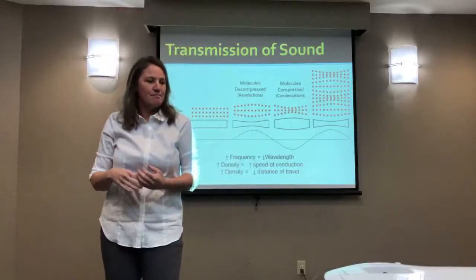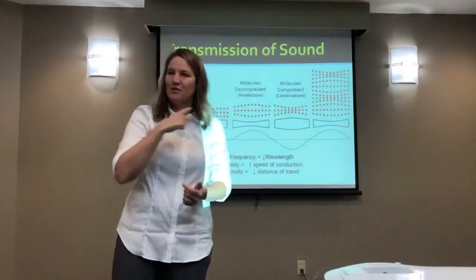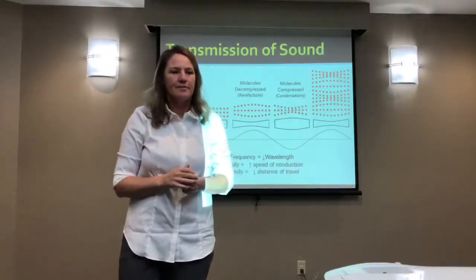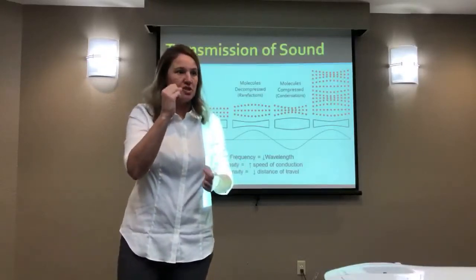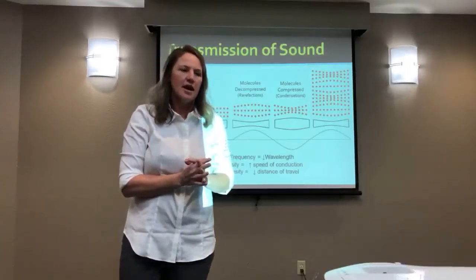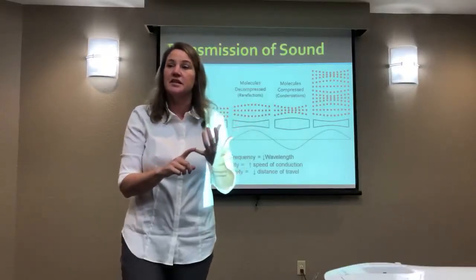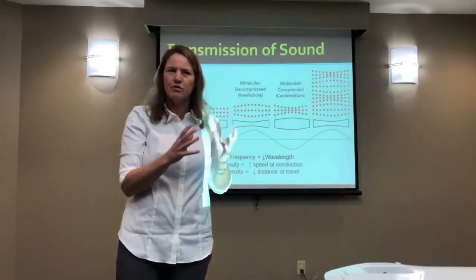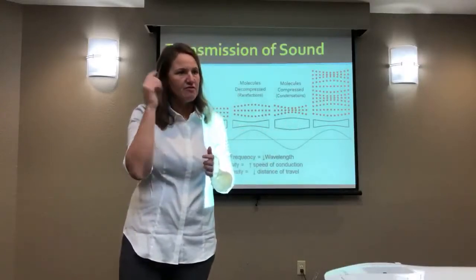The intensity is kind of the height of the people in the arena. It's how hard you push. So if you're pushing harder, it's more of a mosh pit than the wave going around an arena. So that's the intensity of that pushing and pulling. And then the frequency is how fast that vibration occurs. So that's the basic premise of ultrasound and how the energy is passed on. And when we start talking about the density of your tissue, the frequency, the intensity, all that stuff kind of makes sense when you think about that same analogy of people vibrating.